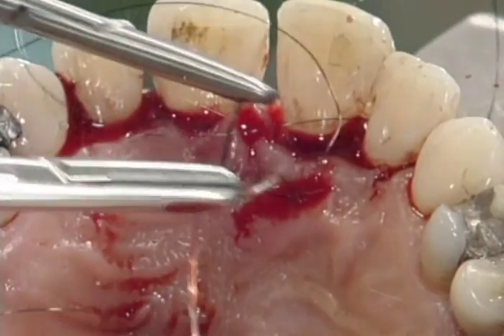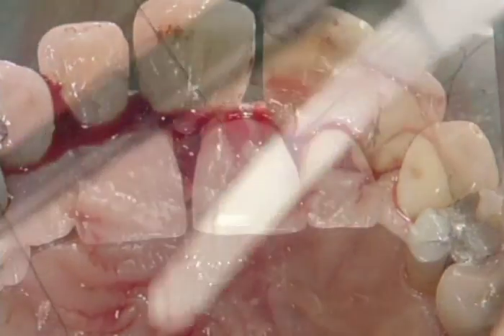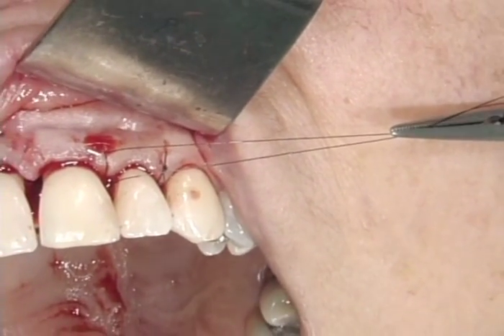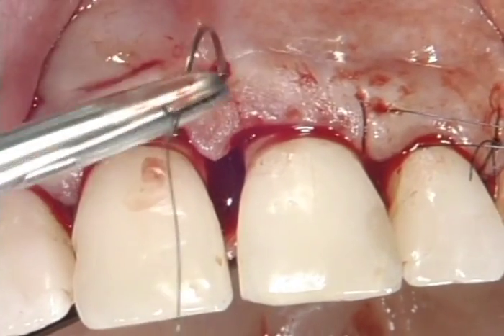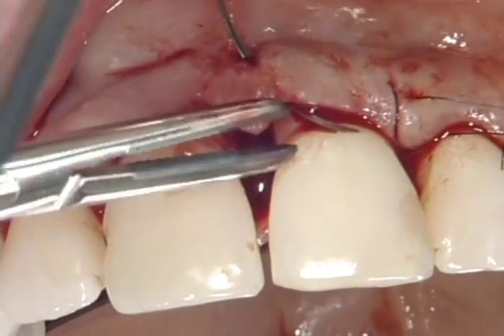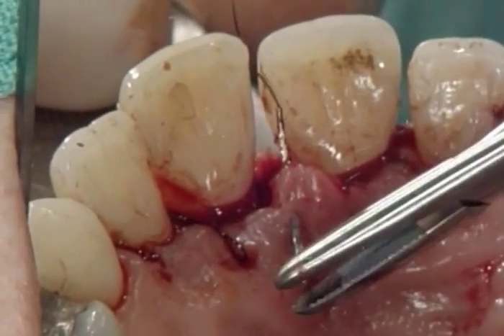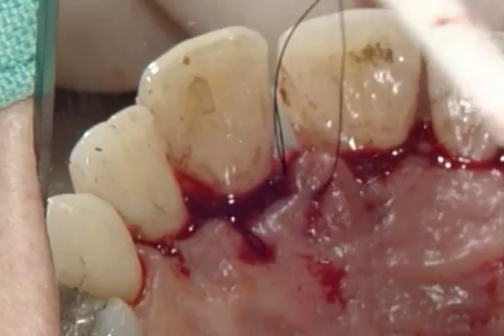The mirror provides a good view of the suturing. Little mosquitoes are used to retain the thread ends and to keep the different sutures apart. Good pre-suturing will help achieve tension-free primary closure that will follow later in the procedure. The central pre-suture is carried out in the same manner.